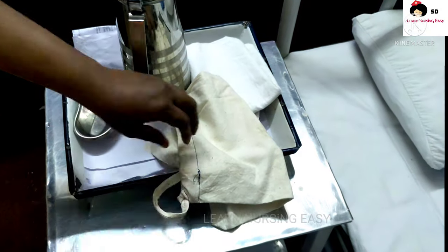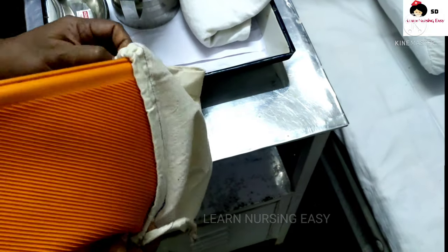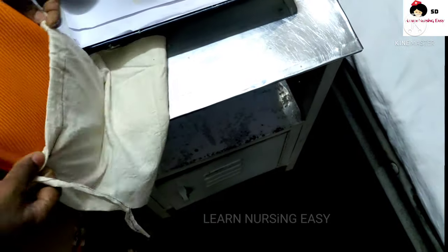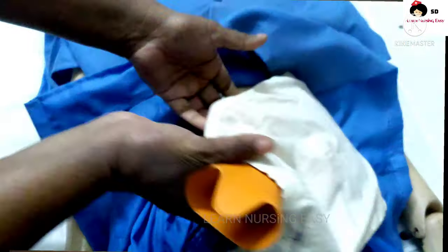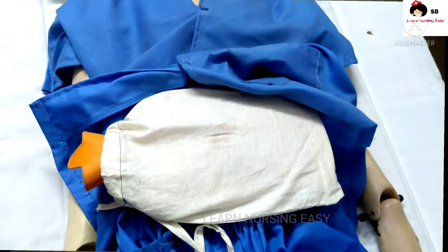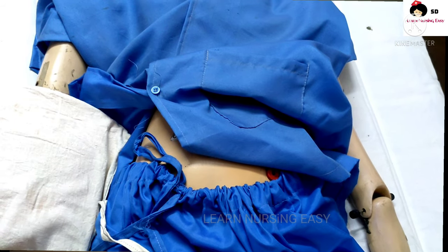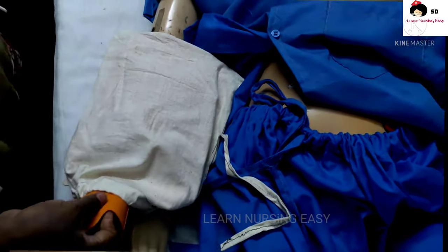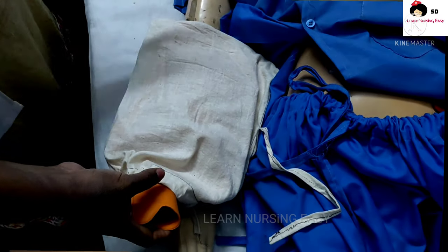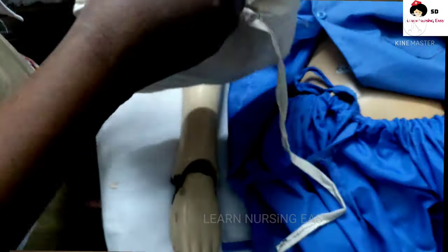Cover the hot water bottle with a cover bag or towel. Make sure the rubber portion of the bottle is not touching the patient's body. Inform the patient that you are going to do the procedure, then place the hot water bag on the area where there is pain — such as the abdomen, legs, or hands. Ensure the hot water bottle is kept on the patient for only 10 to 15 minutes, as keeping it longer in the same place can cause scalding or burn injury.